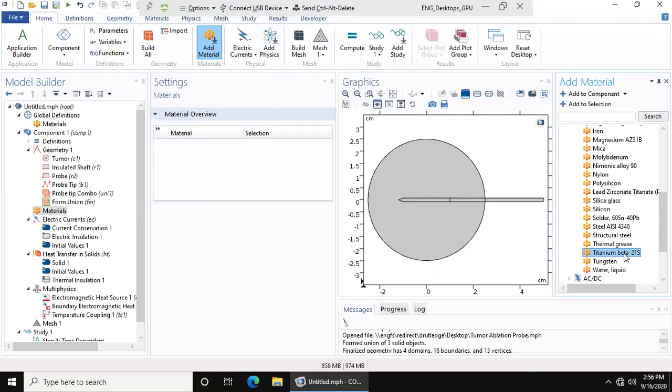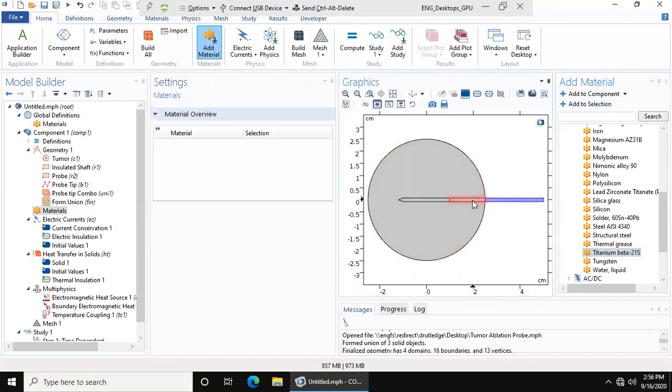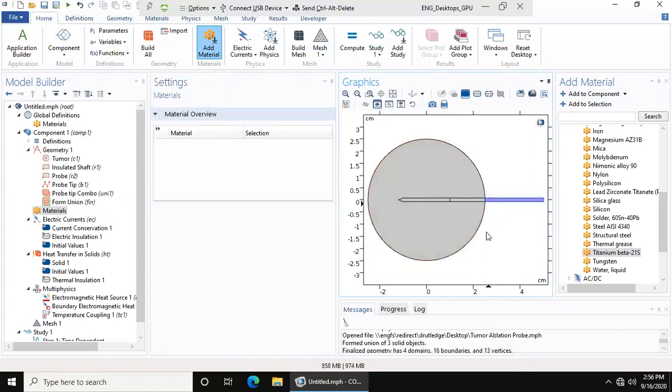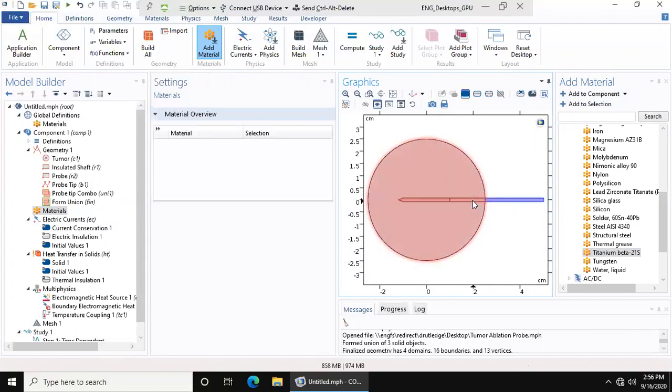I chose to use titanium because it's a very stiff material that I feel like would be easy to use to stab into a person. We're going to choose the geometries that we want to add this material to. You can tell that this circular tumor geometry has separated the two geometries in the insulated shaft, so make sure to select both of them.